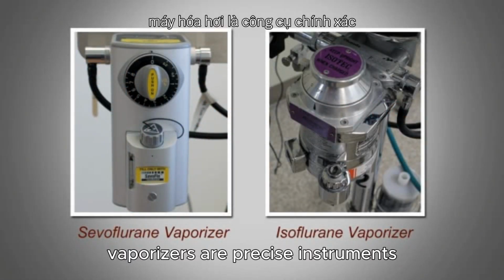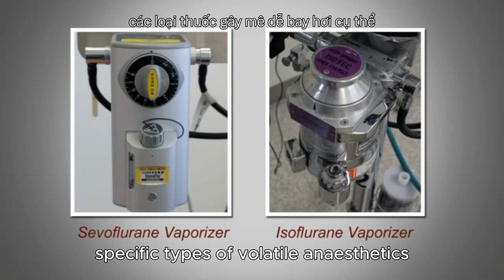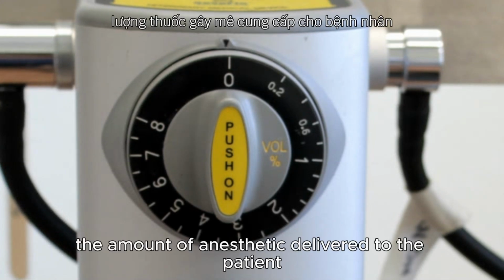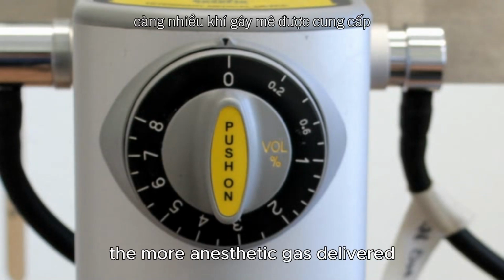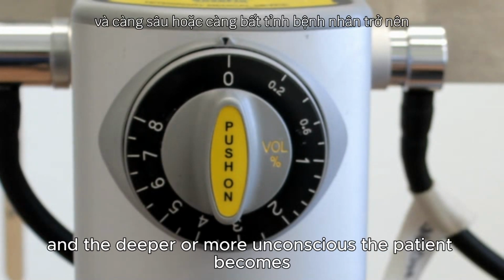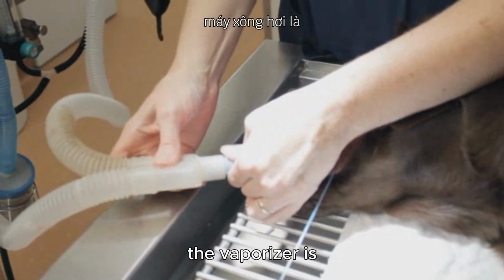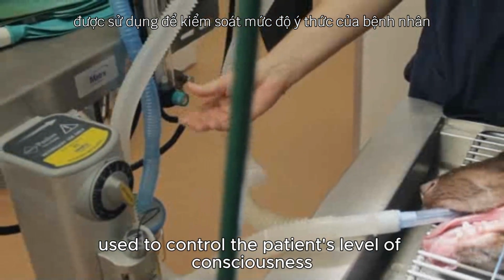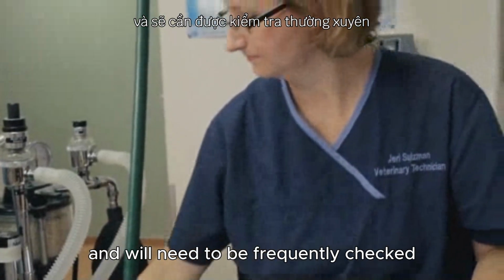These drugs start as liquids and are vaporized to produce the anesthetic vapor. Vaporizers are precise instruments designed to accurately vaporize specific types of volatile anesthetics. There's a large dial on top of the vaporizer that controls the amount of anesthetic delivered to the patient. The higher the percentage, the more anesthetic gas delivered, and the deeper or more unconscious the patient becomes.